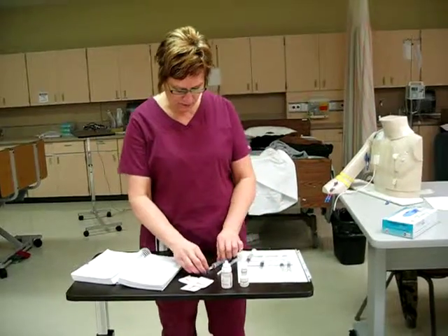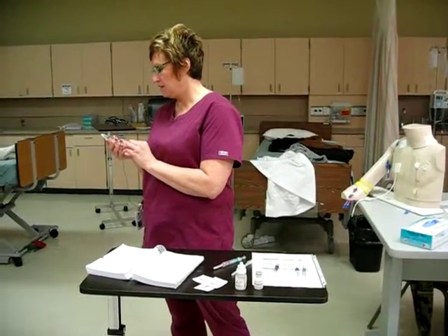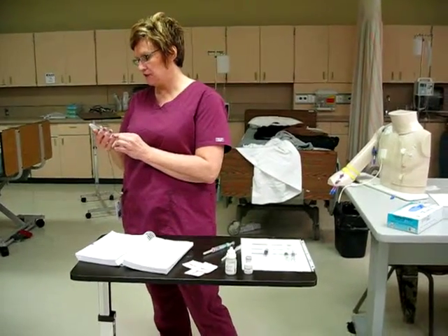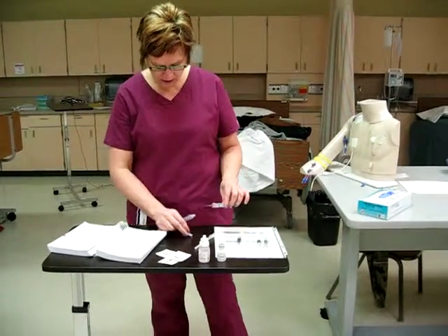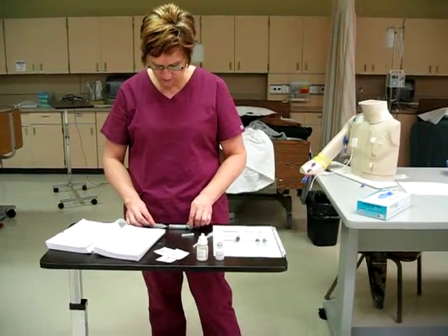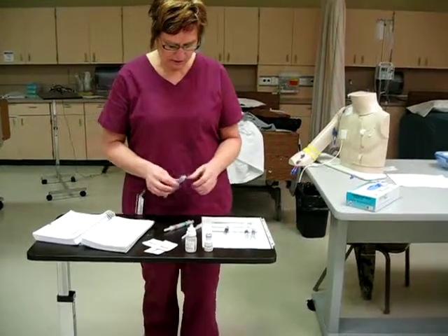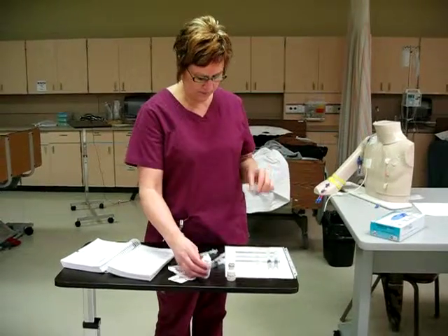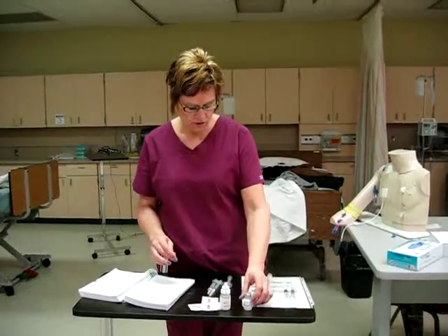Okay, and then I'm also going to prime my NS, and I have 5 milliliters of normal saline, and I'm going to insert my Dilaudid into my 5 milliliters of normal saline, and I'm going to cap this. Okay, so I have my Dilaudid ready.